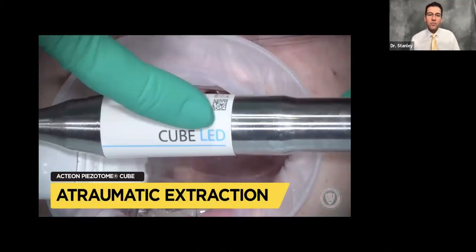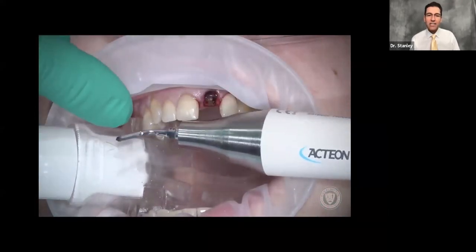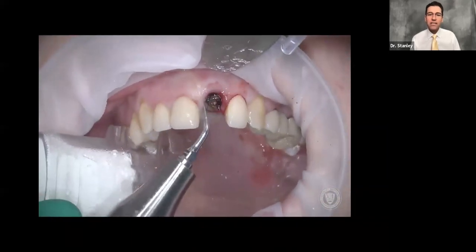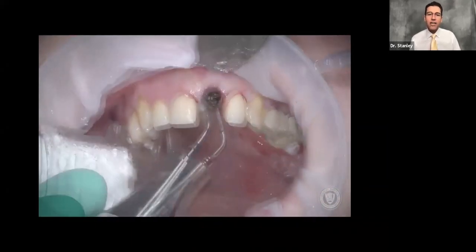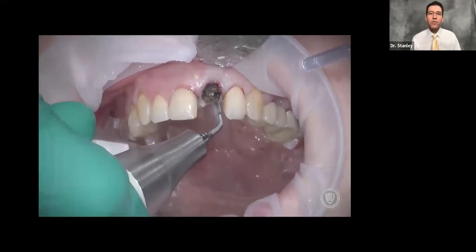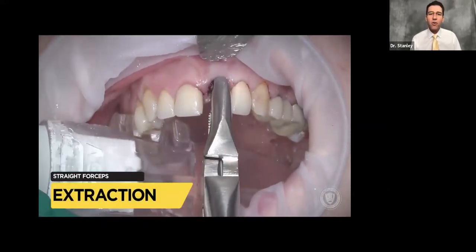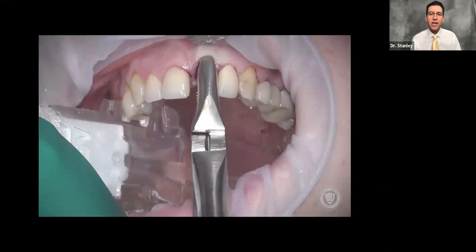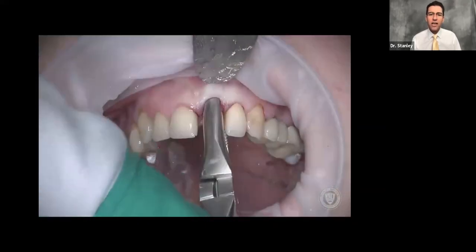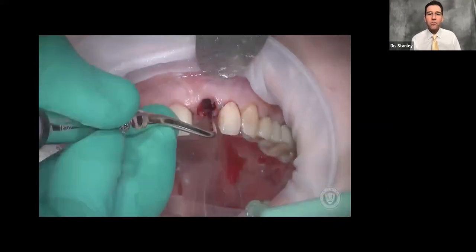The first thing we do after we get them numb is elevate the tissues gently with a Molt 9. Then we're going to use a product called the Cube, which is a piezotome from Acteon, and go down on the mesial in a rocking motion and on the distal and on the palatal, but never on the buccal as the buccal bone is always really thin. Using straight forceps so you can see better, once we get a hold of the neck, it's just a couple of quick twists and the broken root chip comes right out.